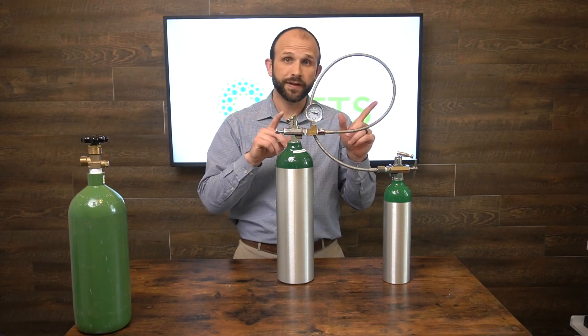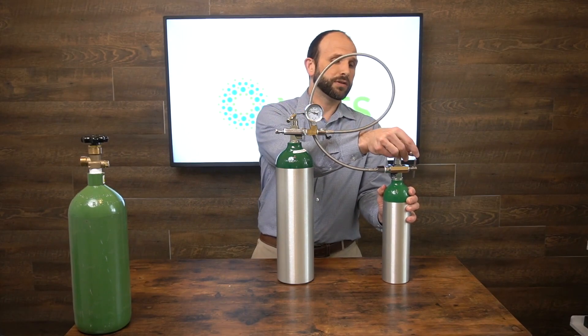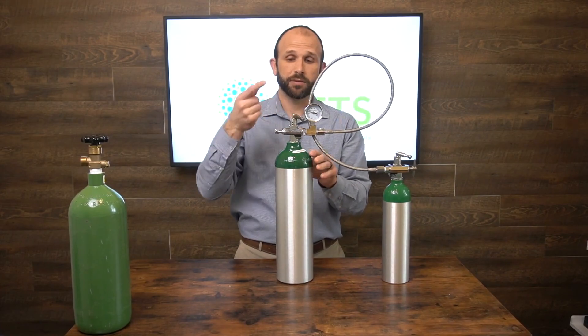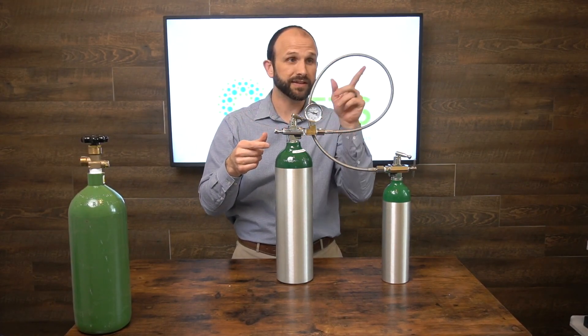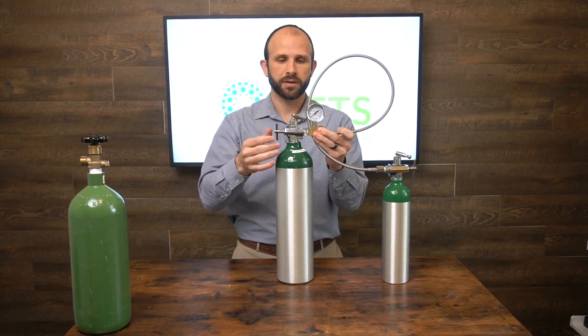Once you're done filling the tank, close both valves and remove the transfer hose. It will hiss as it releases the oxygen that's in the hose — that's not dangerous.